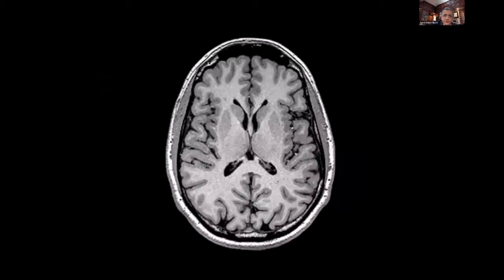Now in here, you start to see the Sylvian fissure over here, right, Sylvian fissure over here, and outside lateral to that, it depends how it was cut. It can be the operculum from the frontal lobe, or it can be the operculum from the temporal lobe. So that, you know, it can confuse you, but don't confine yourself by saying this is what it is. Look at the images above and below. The lateral ventricles are very clear. The caudate is very clear over here. The putamen and globus pallidus, and the thalamus, and this thing you remember. This is something that one has to remember.